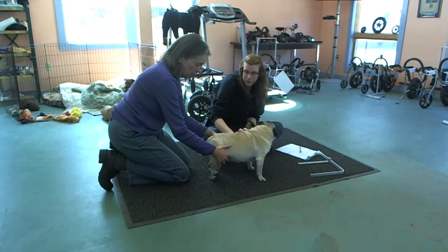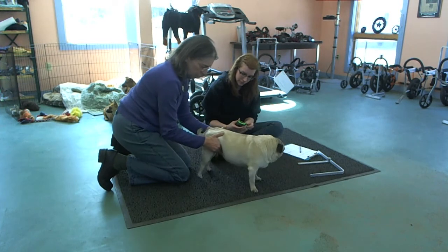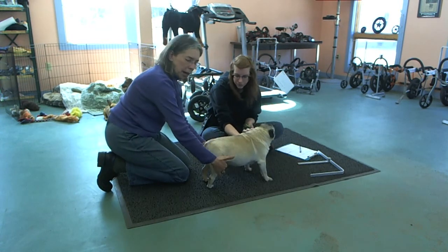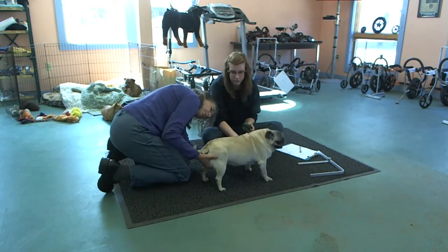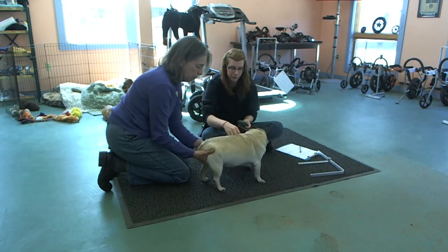You can see Kayla. What we need to do is hold her up. I'm going to hold her right here in front of her thighs on her pelvic floor, and we're going to make sure her top line is level. We're not holding her up higher than her normal stance, and now Hannah's going to take her measurements.